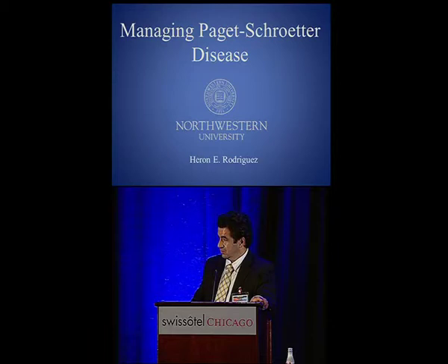And we actually got a guide wire to go right through the clip. But the small balloons wouldn't do anything to it, wouldn't even budge the clip. But the next day we put in a larger balloon over an 035 wire with a pull-through, and we actually just opened the clip, which was amazing, and proceeded to stent it.